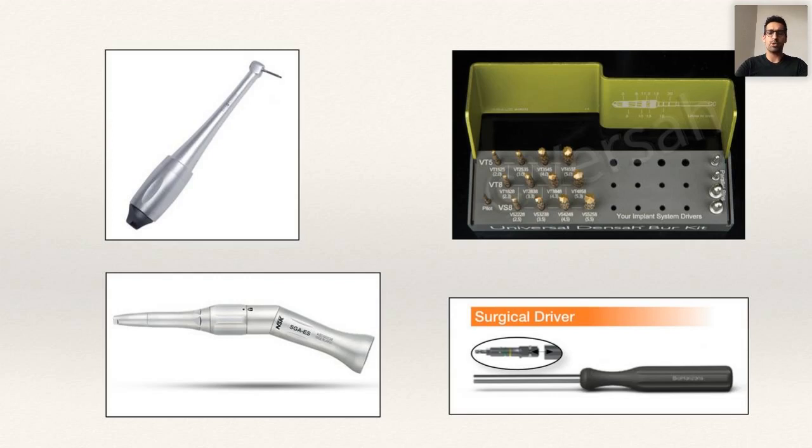It's about, I think, 20 millimeters in length, which is really ideal for placing these pterygoids. And then I will commonly use the 2.3 or the 2.5 to full depth, and then just open up the top of the osteotomy with maybe the 3 millimeter.